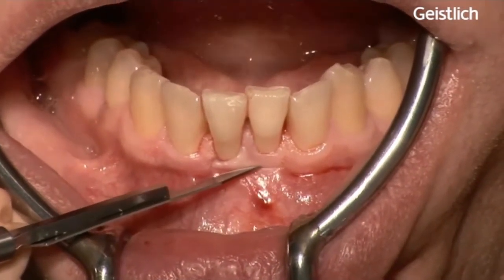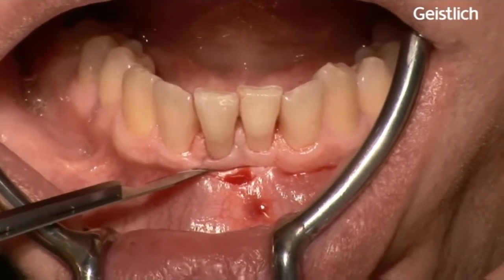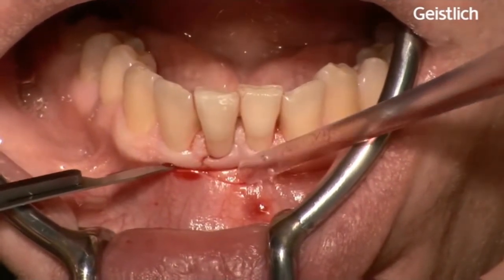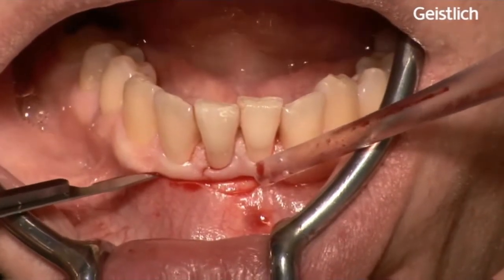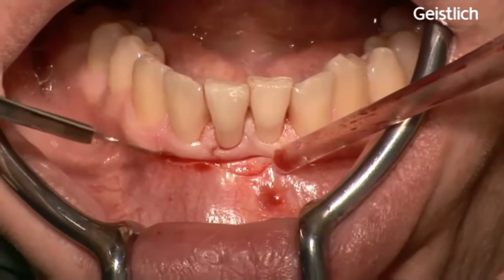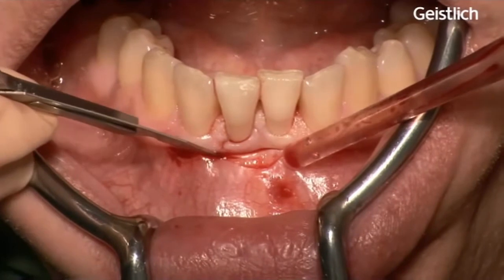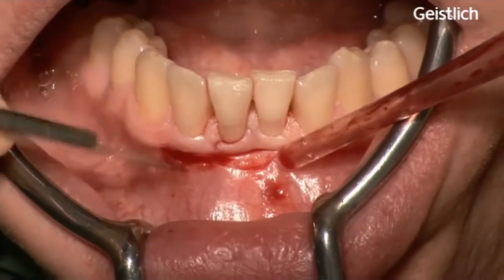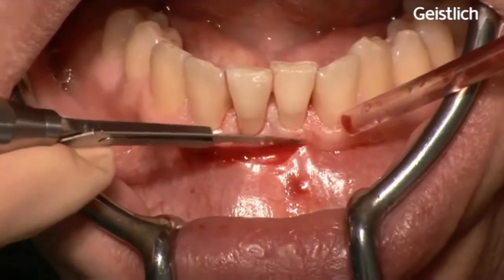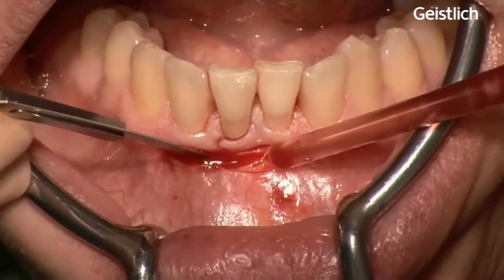It is important that a minimal band of keratinized tissue is present in the treated side or in the surrounding tissues. A split-thickness flap is prepared and care has to be taken not to cut through the periosteum. We proceed downwards until it is possible to move the flap passively in an apical position.